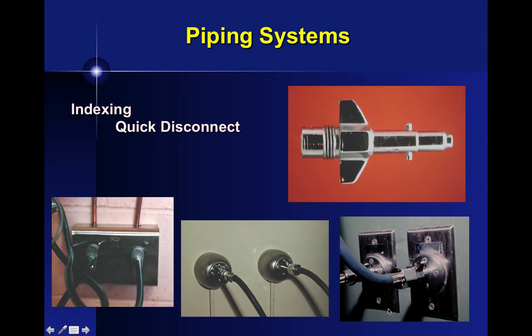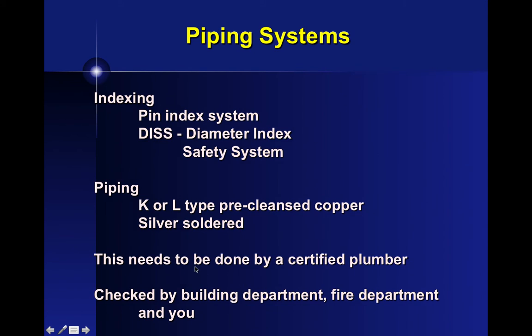This is a much nicer looking installation from the University of Oregon. We had an inspector come to our office and say, well, you can't use that anymore because those pipes are on the surface of the wall, and because you drive cart stretchers and trucks in your office, you could puncture one of those lines. And I explained to him that we didn't use cart stretchers or trucks in the office. Didn't impress him at all. And so we had to have part of the installation redone. The pipes were then inside the wall where they were protected, even though we didn't drive cart stretchers or trucks. This is the device that fits into these, connected to your hose. Each outlet will have a different setup, so they need to be matched.